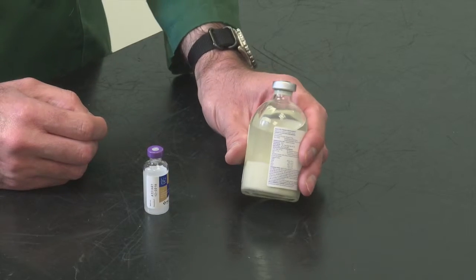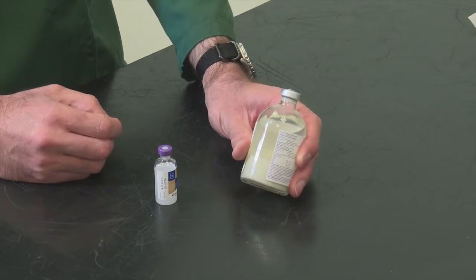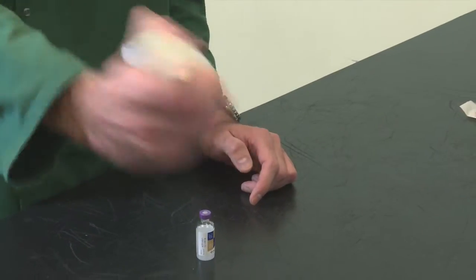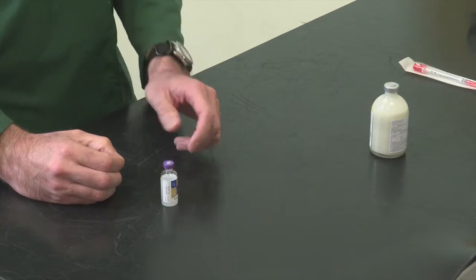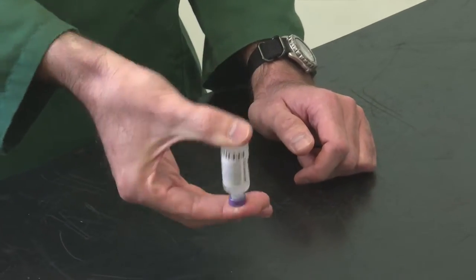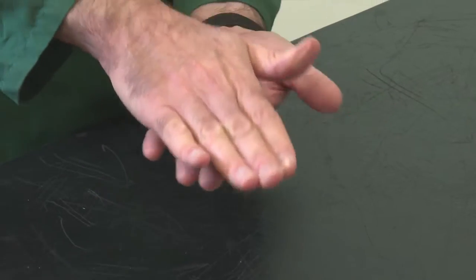With antibiotics we can be quite vigorous with our shaking because the molecules are quite stable, so it is fine to give it a good shake. But with insulin the molecules are quite delicate, so we just need to agitate the bottle rather than shake it — we just rotate it three to five times, or if you prefer you can roll it in your hand.